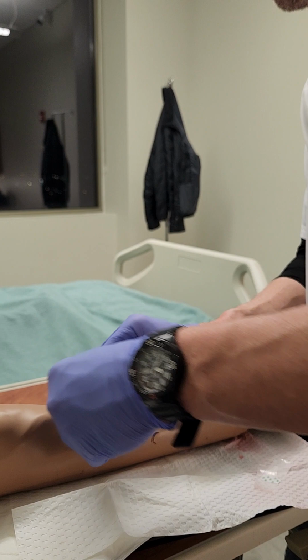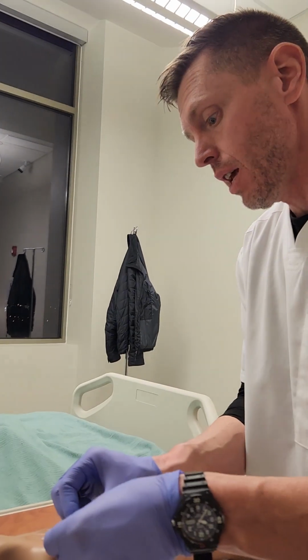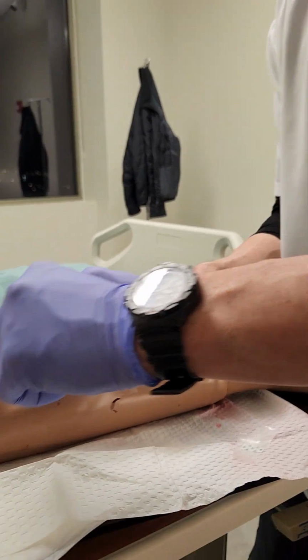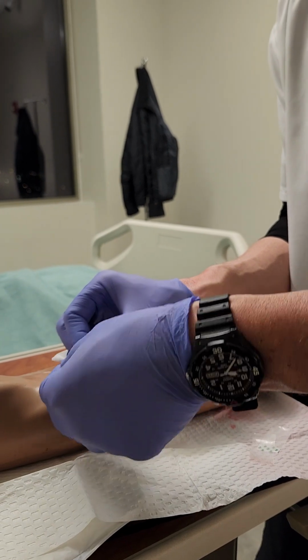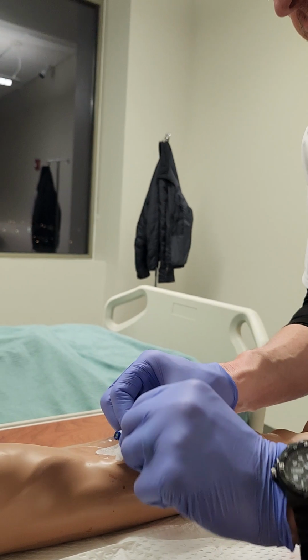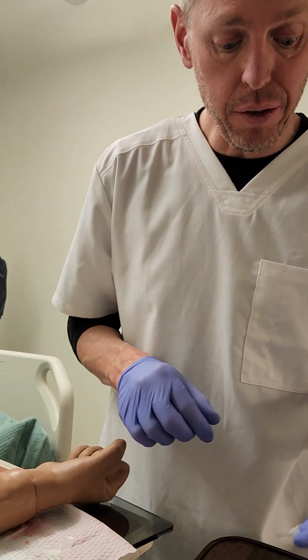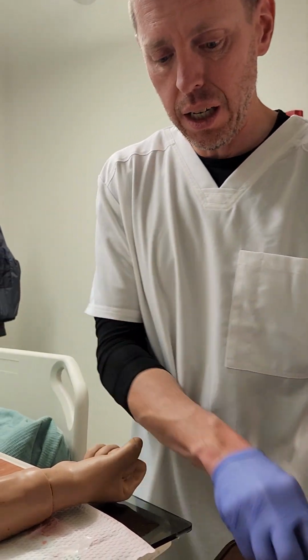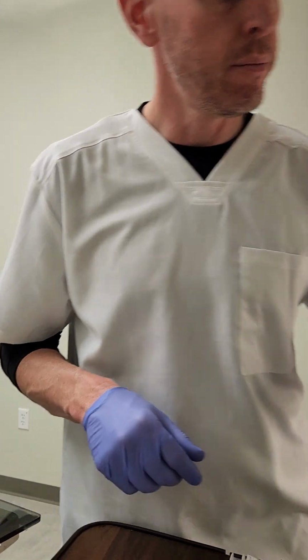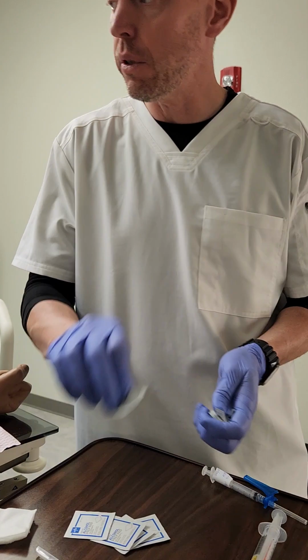All right, how are you feeling? So the clock starts now. I'm gonna be hanging out with you for 15 minutes. I gotta chart what I just did. And in 15 minutes, you can tell me if you're feeling this pain or not. I'm also gonna get your vitals again, so I can compare that to the baseline from the vitals I got before. And I'll clean up while I'm doing all this stuff.